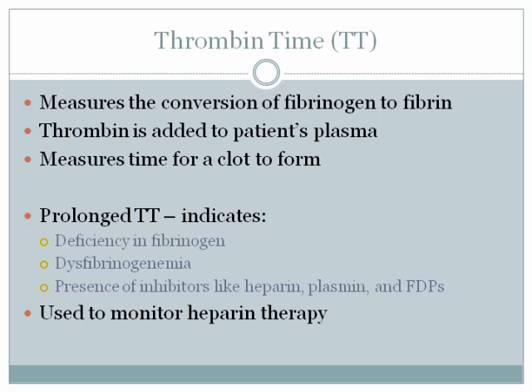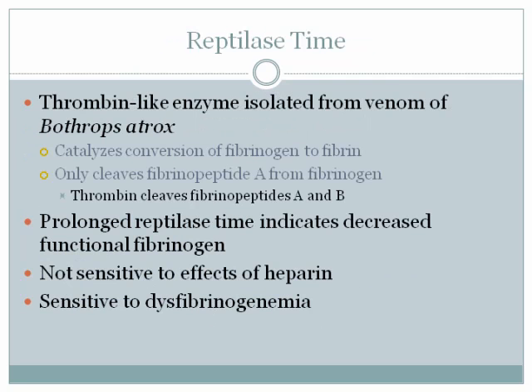So when you look back, thrombin time was sensitive to the effects of heparin. It could prolong it. But in this case, it's not sensitive to the effects of heparin. So if you're worried that heparin contamination might be playing a role in prolonging somebody's thrombin time, they can use this test to make sure. So same thing it's testing for, just different reagents.